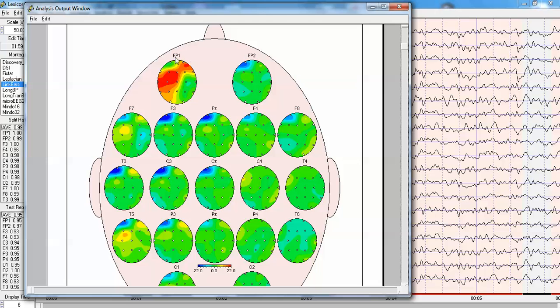In this case, the left frontal lobes, FP1, which are healthy and have not been damaged, have information flow to these areas. For example, F7.